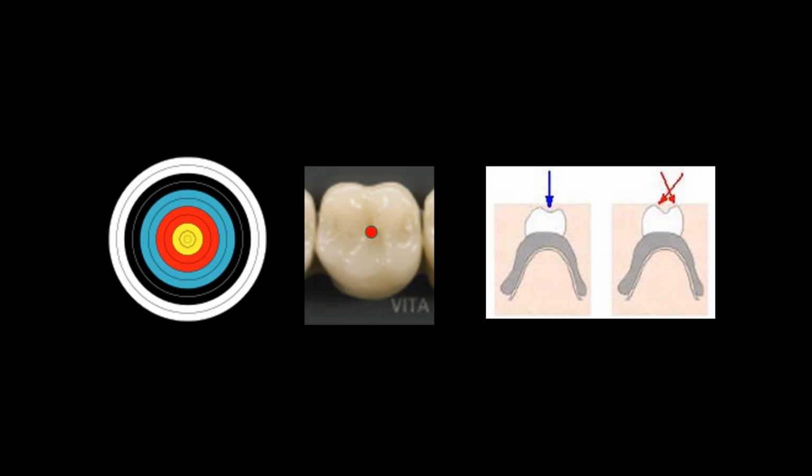You have to imagine the mandible. It is held together with different sets of muscle groups bilaterally that have to function together at the same time. Holy cow. And accurately. And as we get older, I'm not as accurate. Our muscles change, our nervous systems change. So now we need to use denture teeth that have it. And since I've been using denture teeth that have that wiggle room and that freedom, because freedom is good, what happens? It's really been an eye-opener for me for patient success.